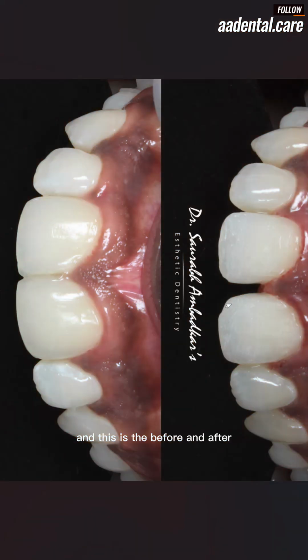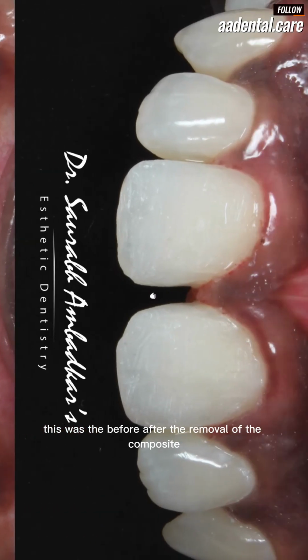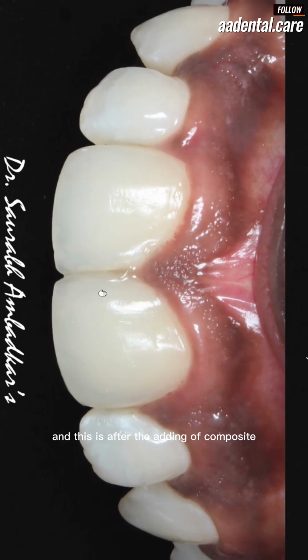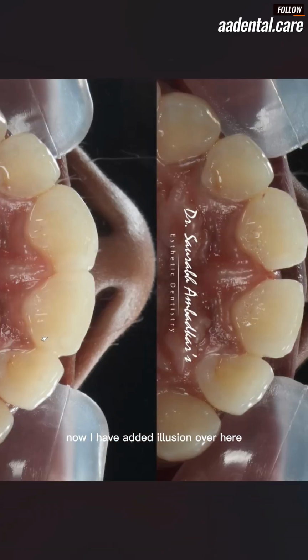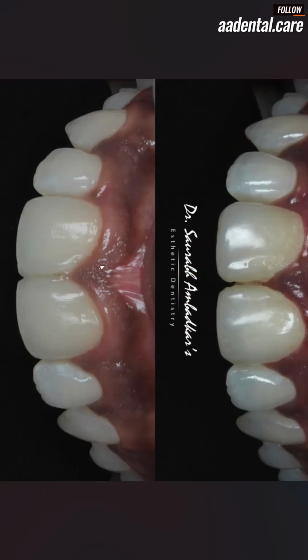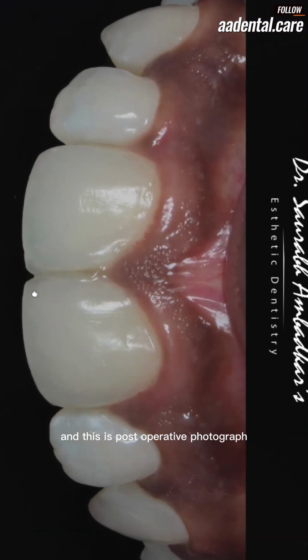And this is the before and after. This was the before, after the removal of the composite. This was the diastema, and this is after the adding of composite. You can see the gingiva very well adapted to our composite. Now I have added an illusion over here so that the tooth should not look very wide. This is the before and after of the palatal view. Again, this is the pre-operative photograph, and this is the post-operative photograph.